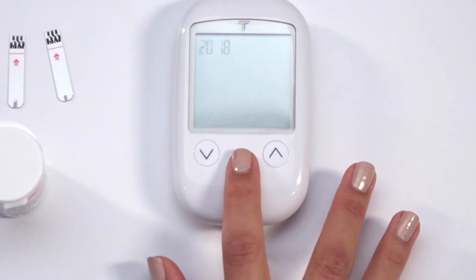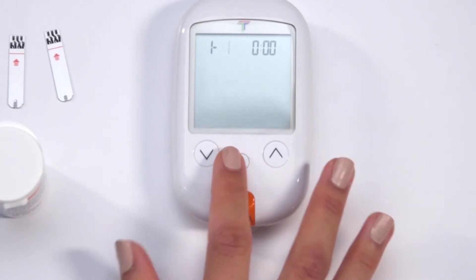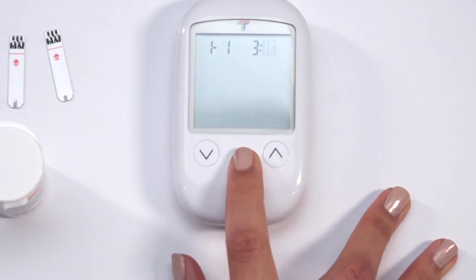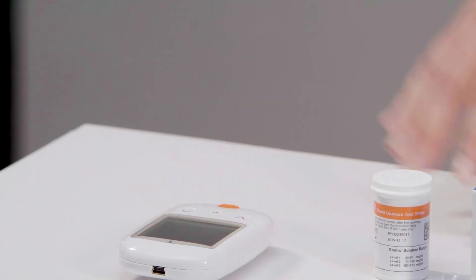The calendar year, month, day, hour, and minutes. Once you confirm the minutes, the set date and time will be displayed on the screen. Press M to turn the meter off, completing the setup.